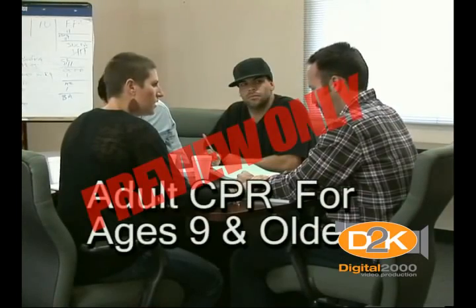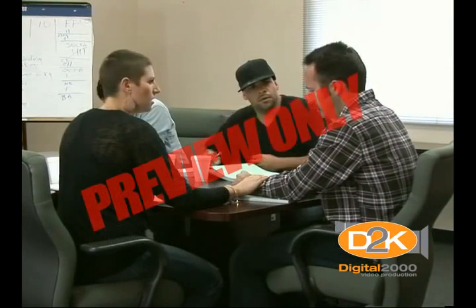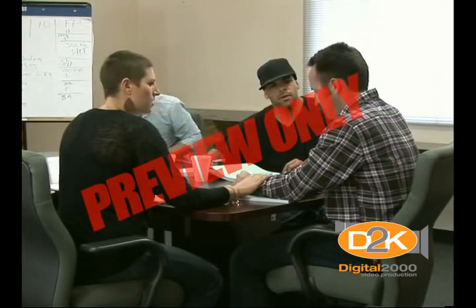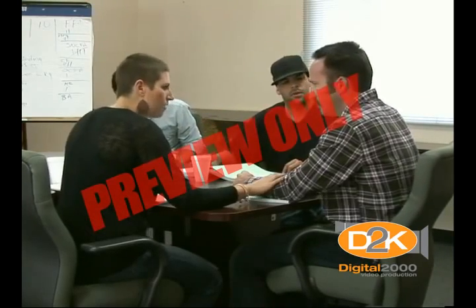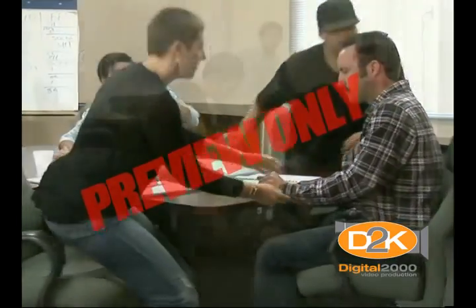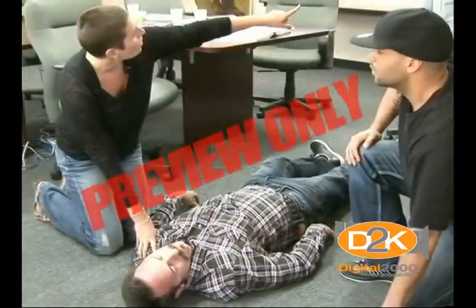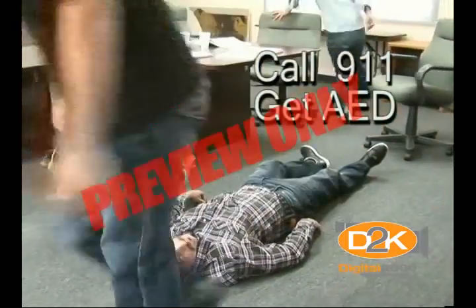Are you okay? I feel a little pressure in my chest. Looking a little pale, man. You okay? I feel good. Getting kind of sweaty there, dude. Are you sure you feel alright? Do you need me to call for some help? I think I just need some fresh air. Why don't we help him to the ground, you guys? Oh my gosh. Gabe, are you okay? Anthony, go call 911. Okay. Adam, grab the AED.